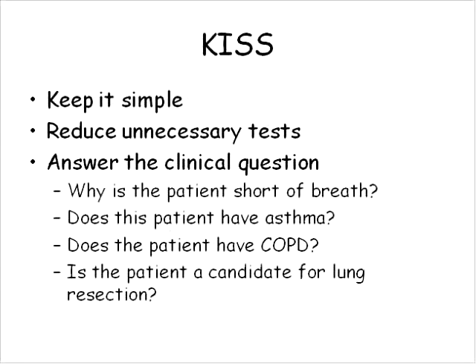I'm going to try, during the course of the presentation, to stick to the KISS principle, which hopefully you've heard of before. It's basically a way to keep it simple. And in terms of what we're interested in here today, pulmonary function labs are really no exception. We need to keep it simple as well. And I think the first objective in terms of doing that is to think about whether or not we do tests that are really necessary for the best diagnosis of the patient. It's sometimes difficult to maintain simplicity because our computerized systems allow us to calculate lots of different variables. And I'm sure you've all seen spirometry reports that contain 20 or more variables. And for most of these, we don't have a very good idea of even what the normal limit should be.